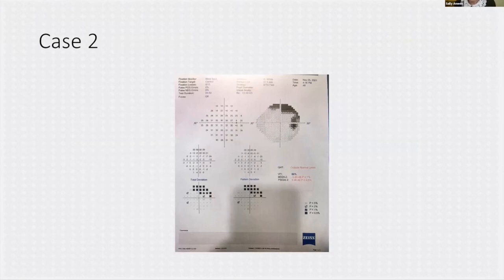The next one that I wanted to show you is a patient that was referred to me with possible, as you can see, visual field loss superiorly. Now, this gentleman has a very strong family history of glaucoma. All of his elderly siblings, as well as both sets of parents, have quite severe glaucoma that has required surgical correction or treatment. So as you can appreciate, he's very anxious, and that's the actual visual field that came in the referral letter, with essentially normal intraocular pressures. So you can completely understand why this patient was very concerned and very worried.